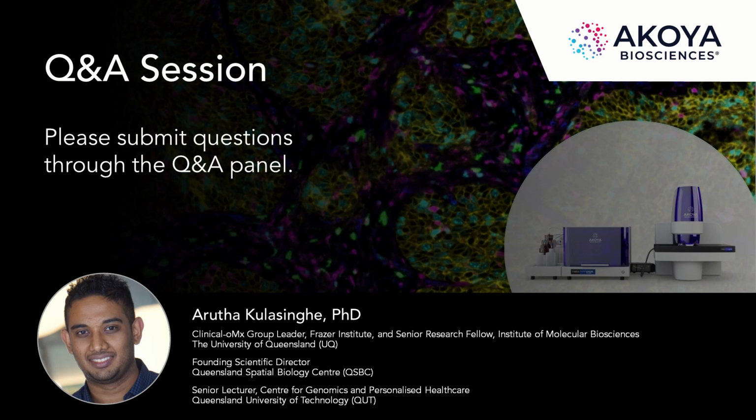Yeah, great question. I think what spatial has done, especially having FFPE compatibility, so formalin fixed paraffin embedded compatibility, allows us to go back in time and look at archival cohorts. You can go into pathology banks and hospitals and look at cohorts that are 20, 30 years old. You can get incredibly well clinically annotated cohorts, where patients might have done exceptionally well to a therapy versus a group that didn't do well. And you can start to understand why these tumors did well almost cell by cell using these cohorts.